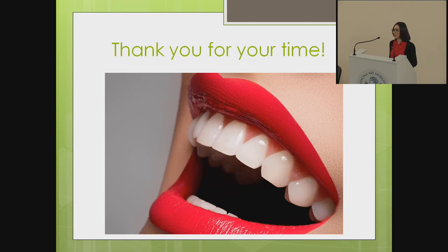All right, so recent studies have compared two of these devices, an air floss and a water floss. Both of them showed a great result in reducing bleeding on probing and also reducing gingivitis, but the water flosser group showed significantly higher results in plaque reduction. So, thank you.